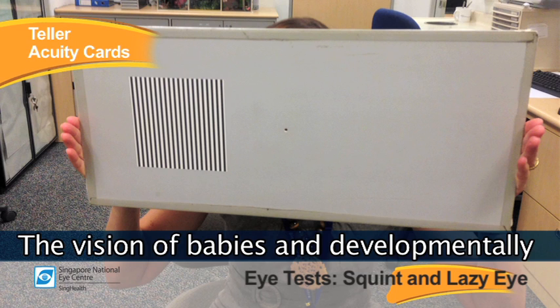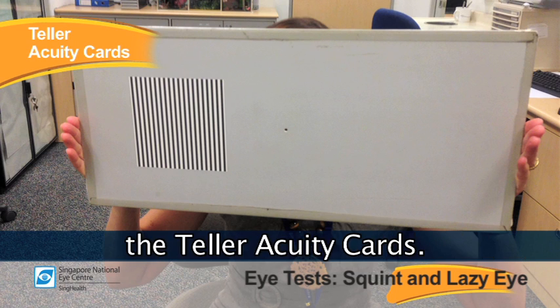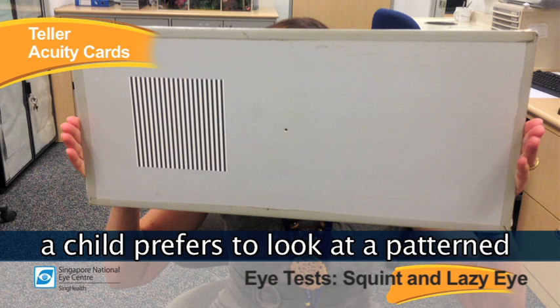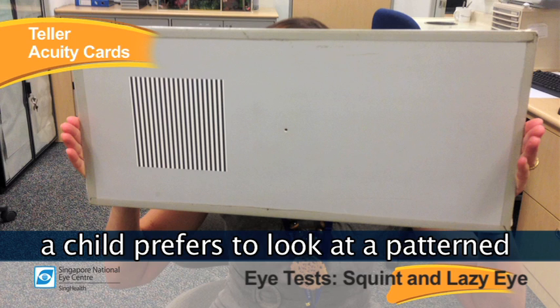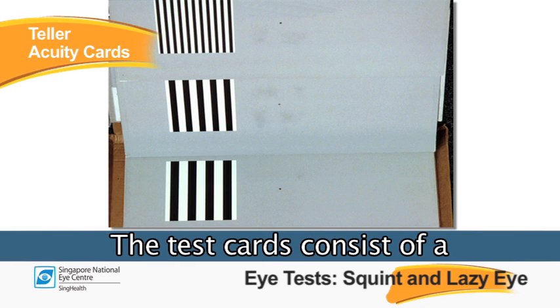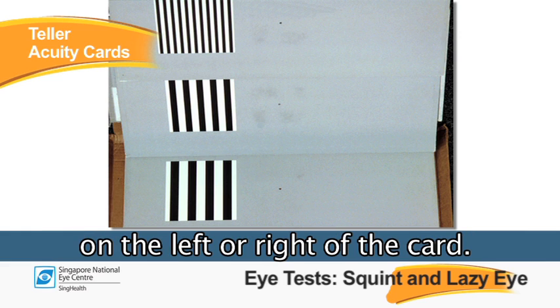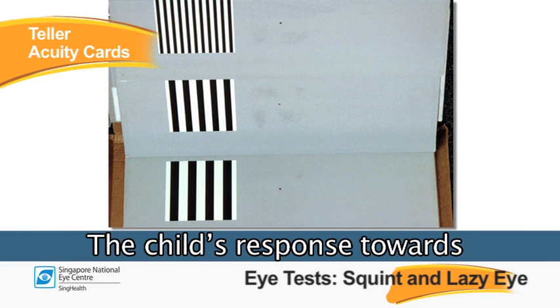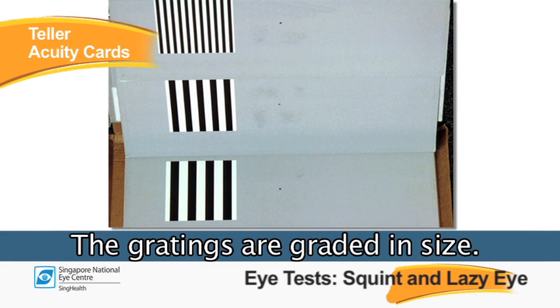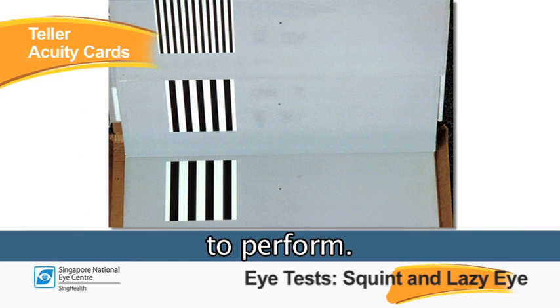Vision of babies and developmentally challenged patients is tested using Teller Acuity Cards. The principle of this test is that a child prefers to look at a pattern rather than a plain background. The test cards consist of black and white gratings placed on the left or right of the card, and the child's response towards the pattern is noted. The gratings are graded in size, and this test takes about 3 to 5 minutes to perform.